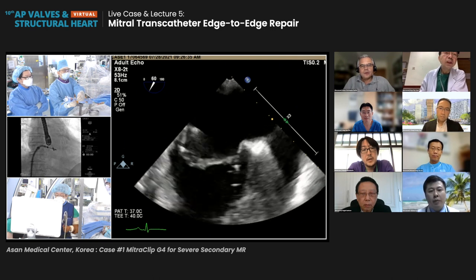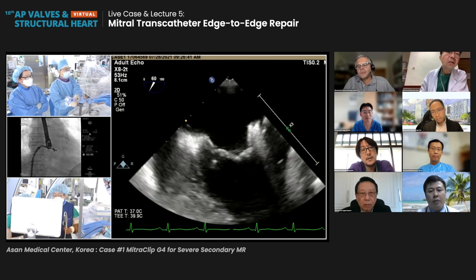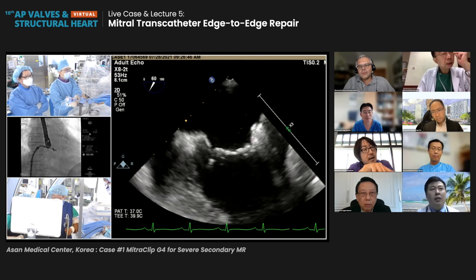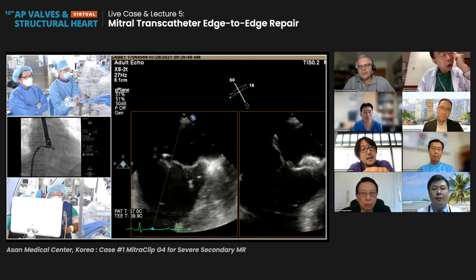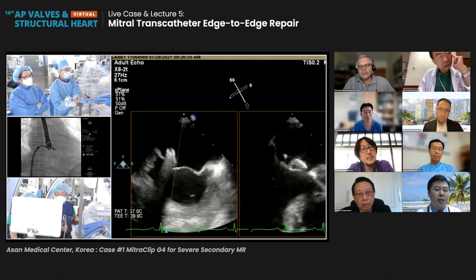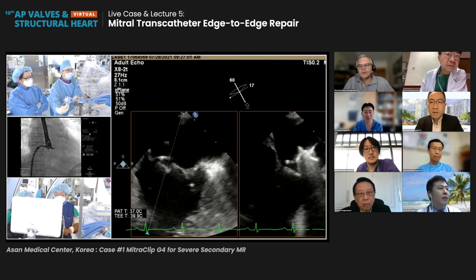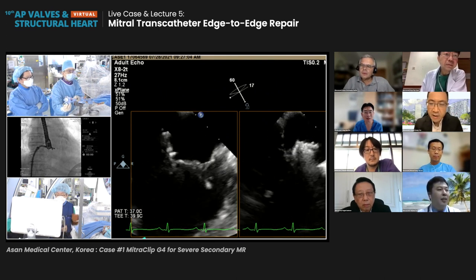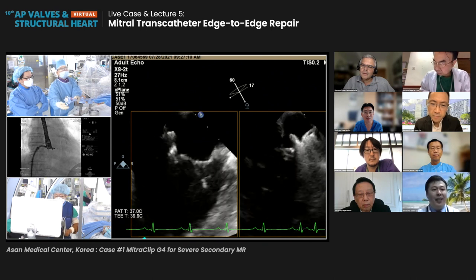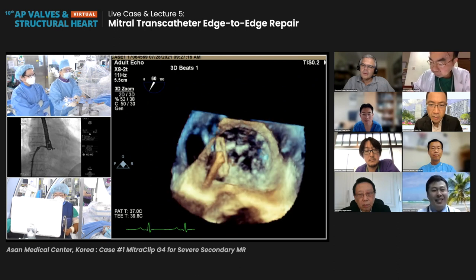As in my presentation, I usually use just standard NT for a non-central position, but this case is a little bit tricky because the patient has mixed etiology, so the LV is dilated, and there's space under the mitral valve. So maybe I would also use NTW, same as Dr. Kang. Agree. We did a similar case yesterday, and we were struggling, so we decided to check the orientation once more with NT. But I think it's an option to choose either one.